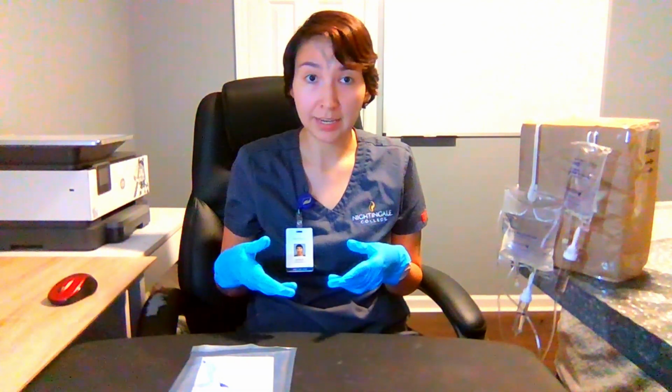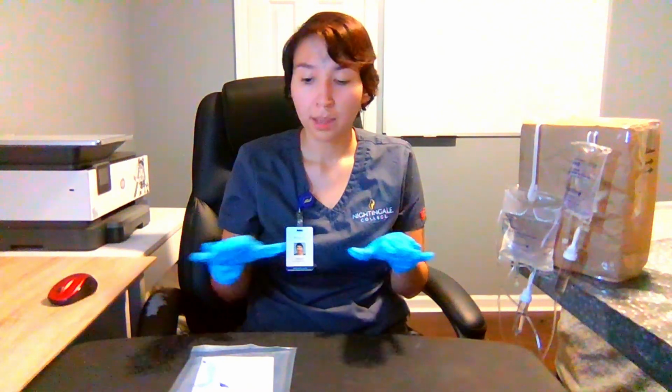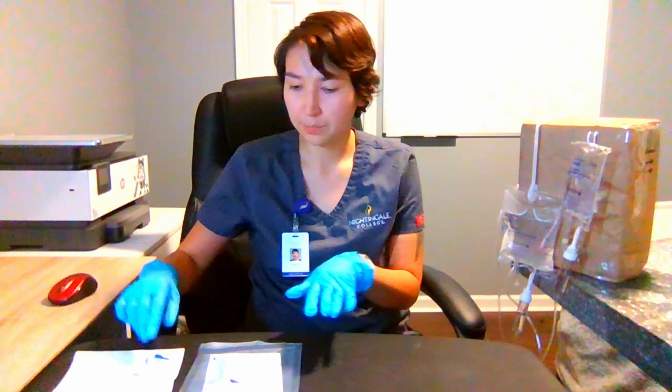I'll assess the IV site to watch for any signs of redness, swelling, or discomfort. I'll make sure that the patient is comfortable, see if they need anything, and make sure that the call light is within reach. Then I'll dispose of any trash appropriately.